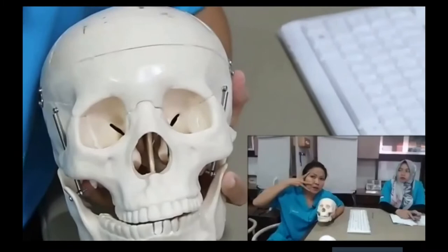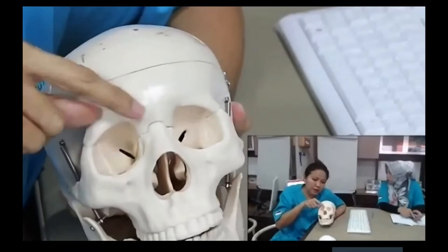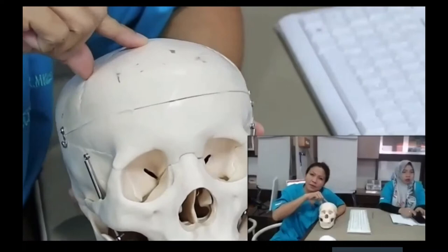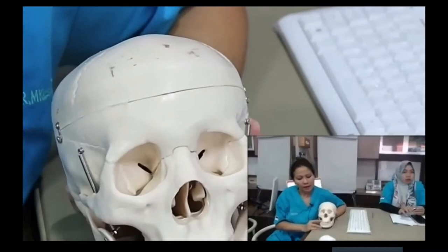Okay, so by doing a blockade of the supraorbital nerve, hopefully we can cover the area innervated by the supraorbital nerve, which is the frontal area here and the upper eyelid through the scalp until the vertex. So hopefully we can treat the patient using this blockade if the trigeminal ganglion involvement is the V1, the ophthalmic branch of the trigeminal ganglion.